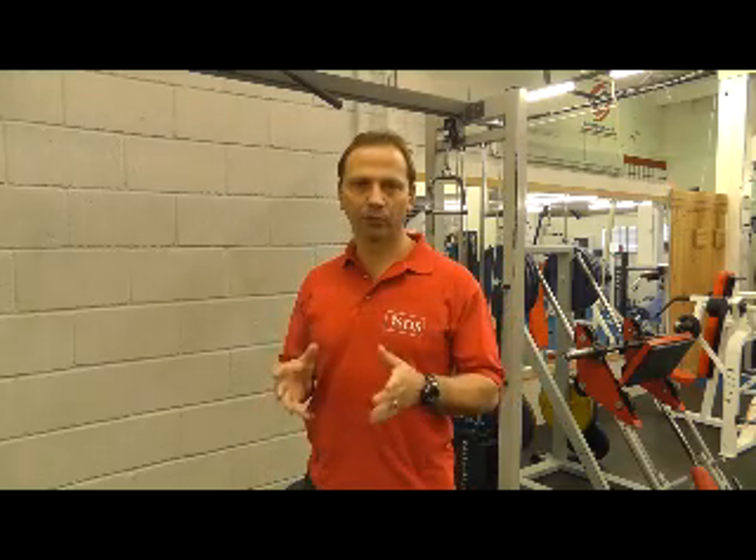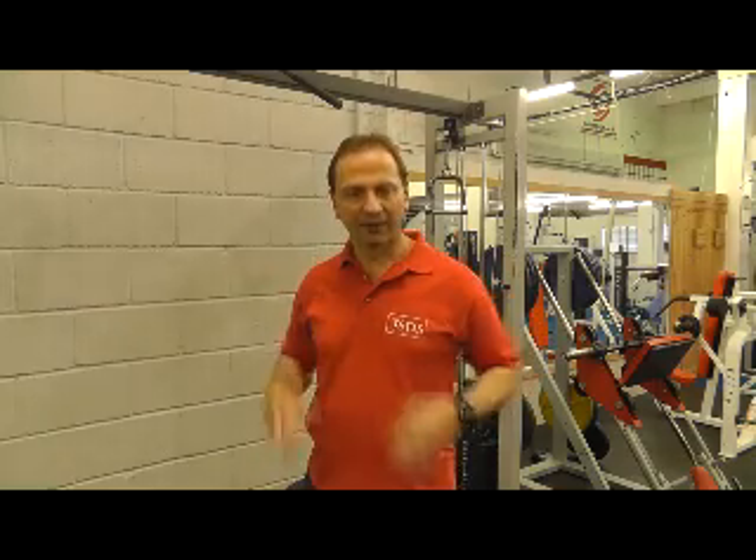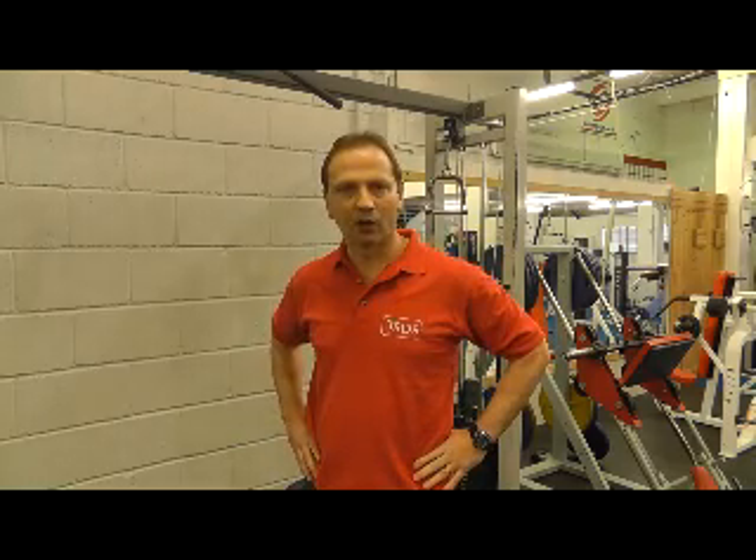In treating back pain, manual therapy gives you precision and sensitivity to feel what's happening in the lower back. But there are times when we need more force to be able to distract and mobilise targeted spinal segments, and that's where IDD therapy uses a mechanical pulling force to achieve that.